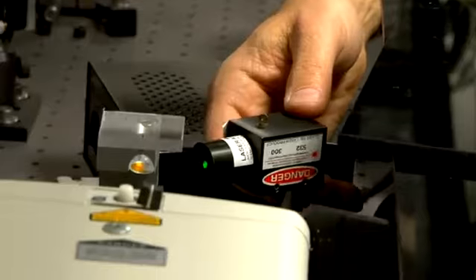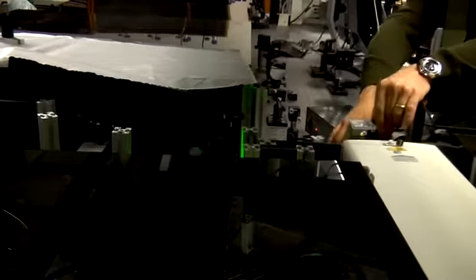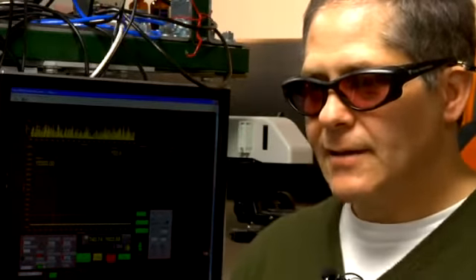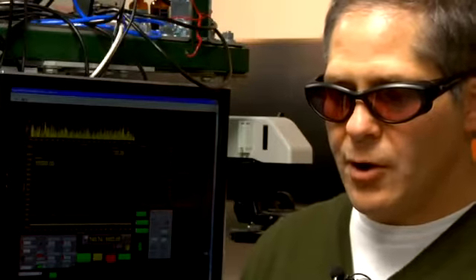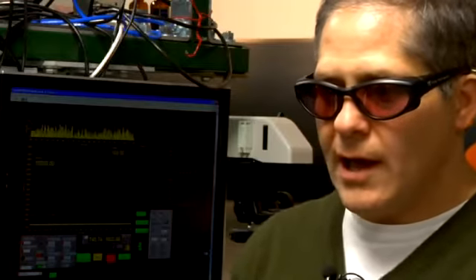Through phase modulation, you are able to selectively excite different compounds and get a differentiation, even though they have very small spectroscopic differences. This method is a way to shape the pulses so that one pulse excites primarily one species, the other pulse primarily excites the other species. When you run very quickly the comparison between the two and you just amplify the difference, then you get outstanding contrast that allows you even to quantify how much of each of the different compounds you're looking at.